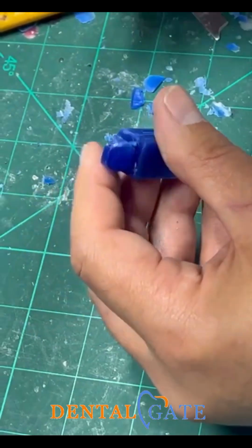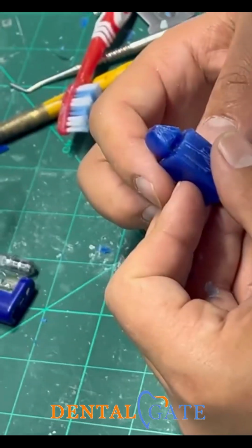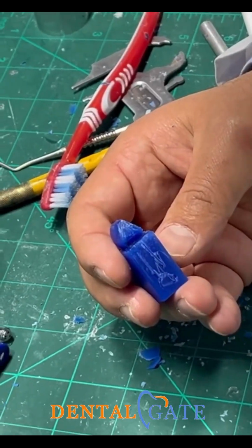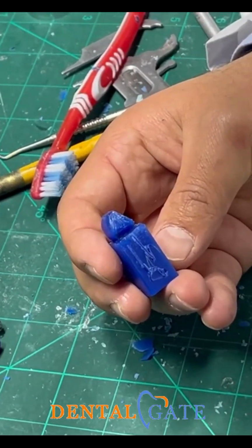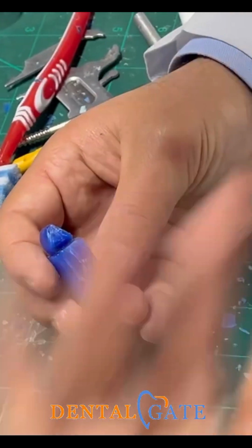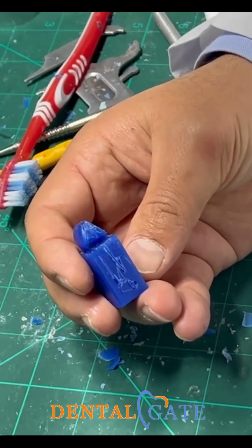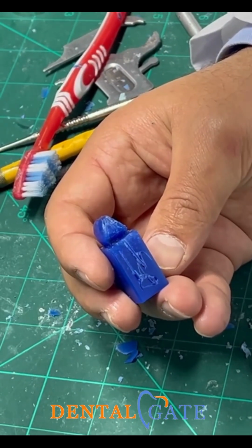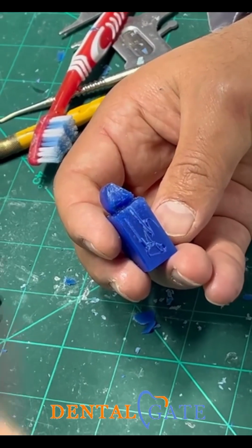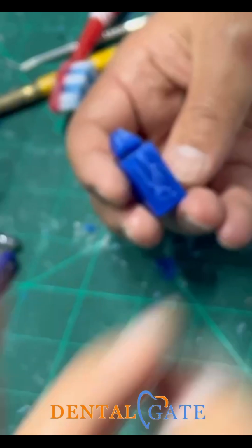You can see this seems a very large lateral incisor, but don't be afraid of this outline. This outline is very useful for you. Why? Because I have a measurement. In the further stage, I need just roundation within the measurement. When I make a roundation and reach the maximum convexity of my measurement, I will stop. Regarding the measurement, through the roundation, the lateral will be constructed.